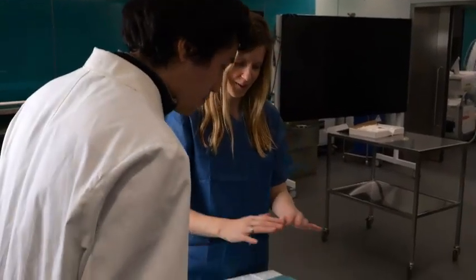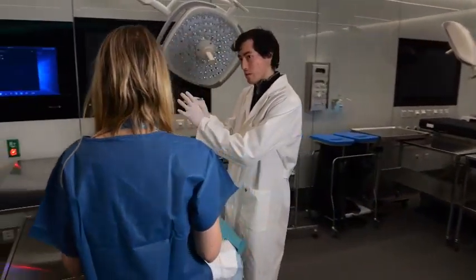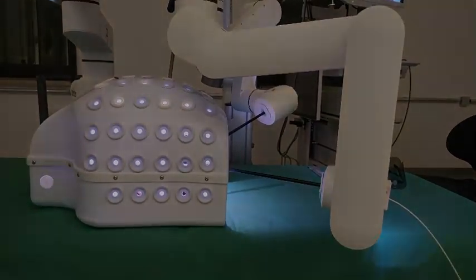Thanks to this platform, we are now able to create nice and damage-free bonds, even in fragile tissues, using a robotic, minimally invasive fashion.